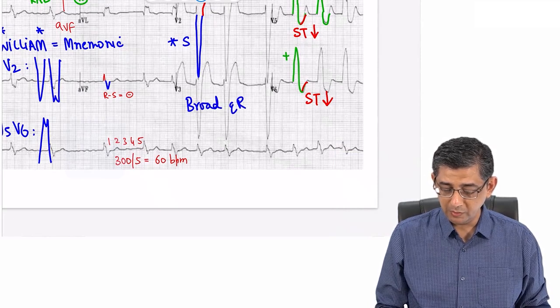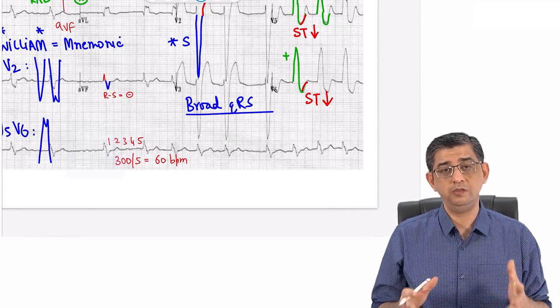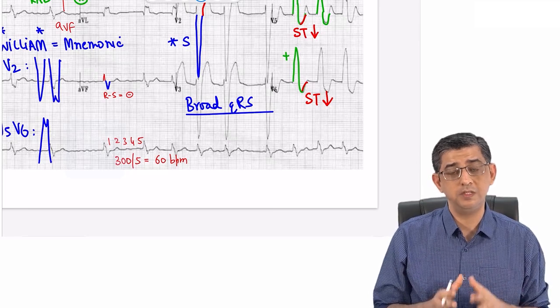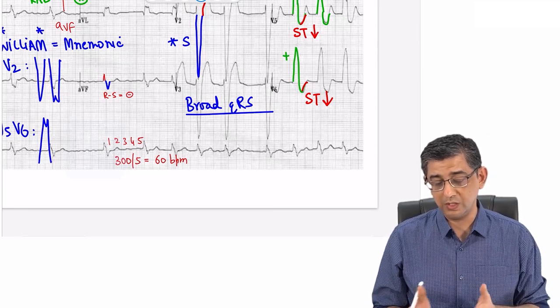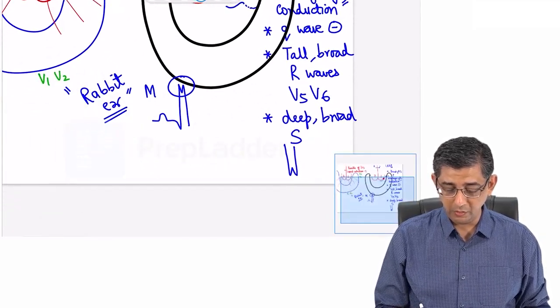I have said this in the end because when I say the word block, not that I'm talking about any bradyarrhythmia, I'm just saying whenever you focus on the English word block, it basically means slowness. And the slowness is what is reflected in the ECG. So all the features that I've highlighted earlier are well documented.